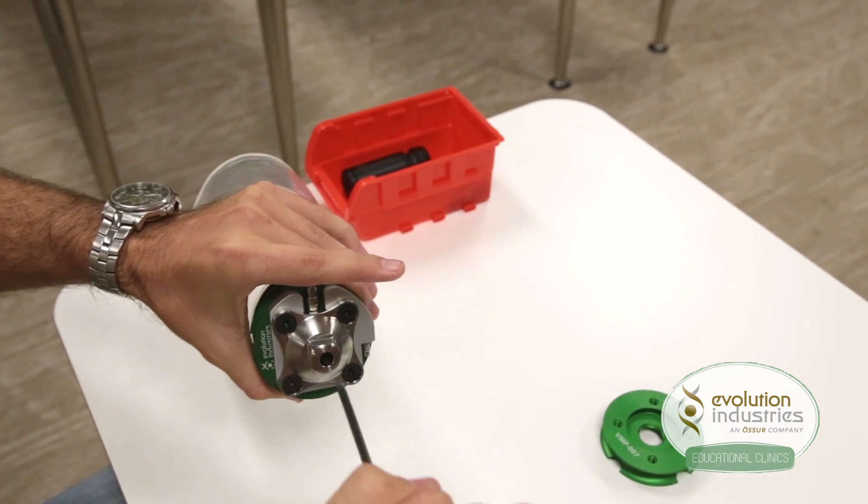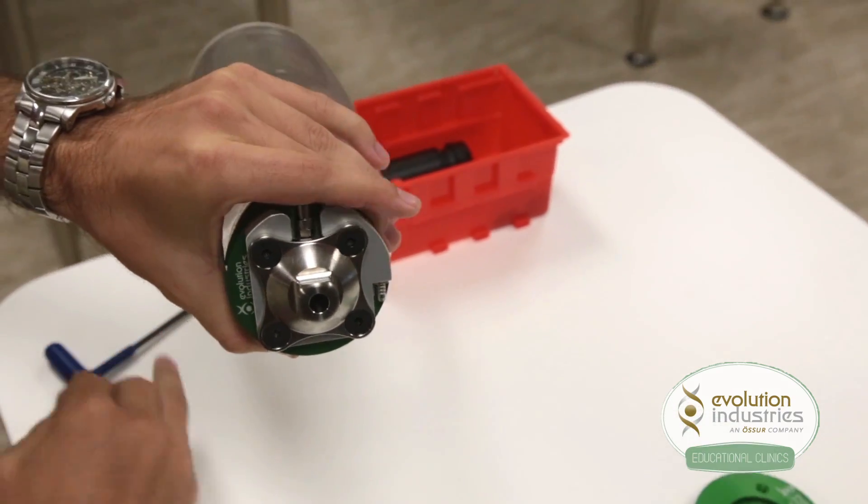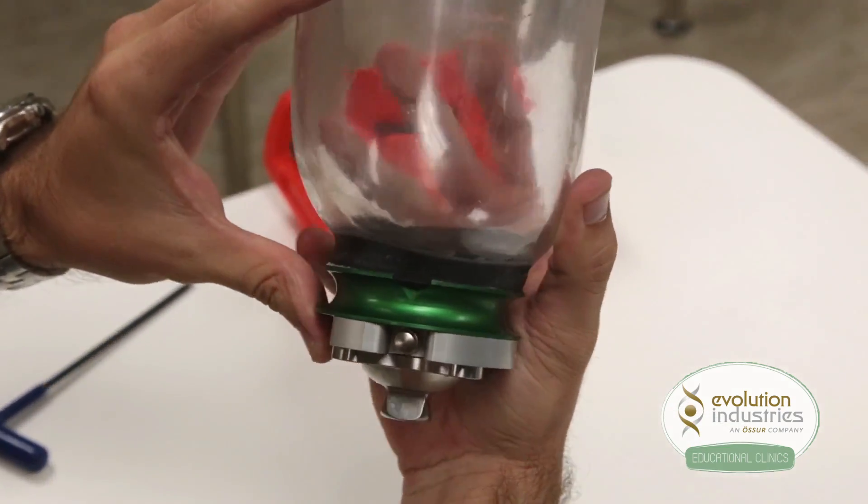Once the screws are tightened, inspect in between the plates to make sure there are no gaps.